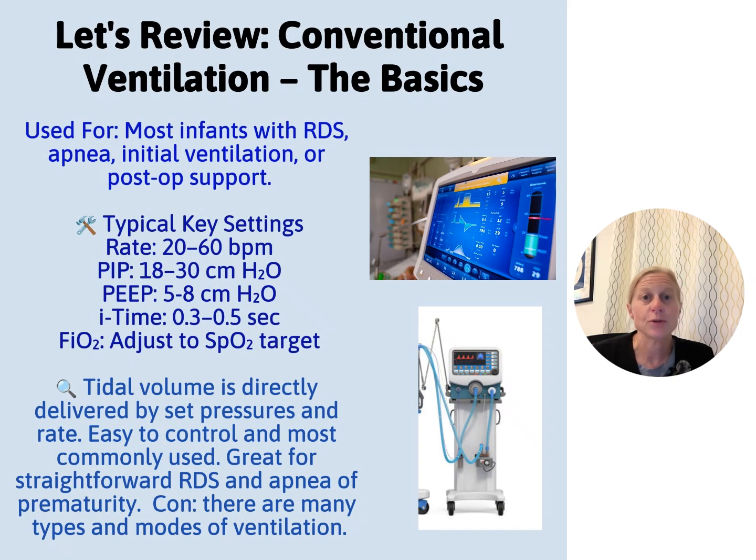We see it used with respiratory distress syndrome. You're going to see it for babies with apnea, initial ventilation. This is often our first line of defense, especially in units that only have a conventional ventilator. We use it for post-op support for our babies going down for operations.